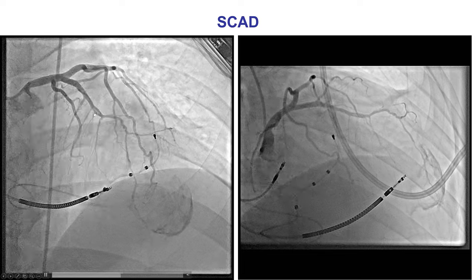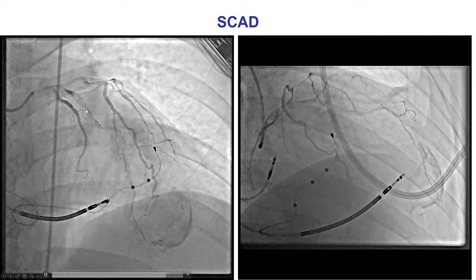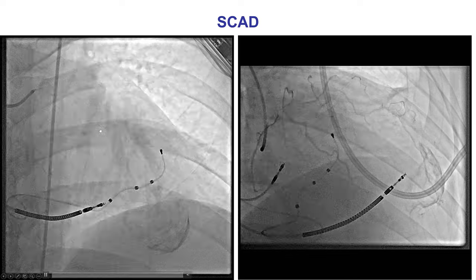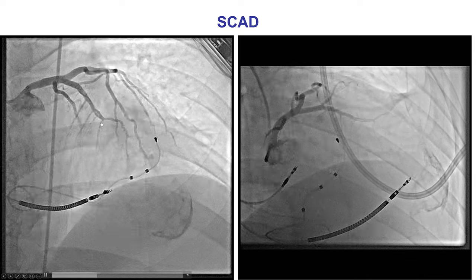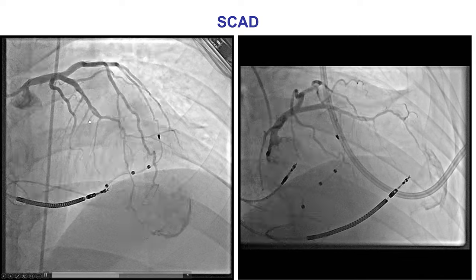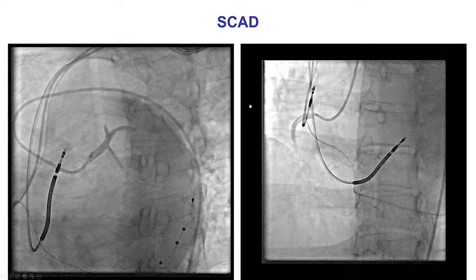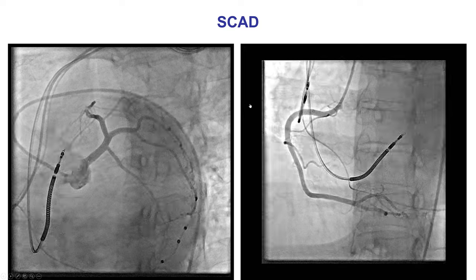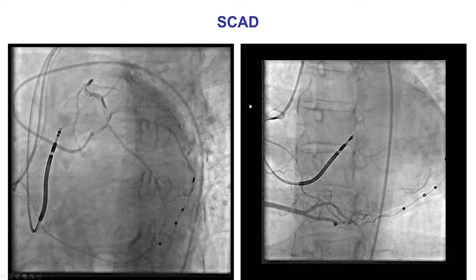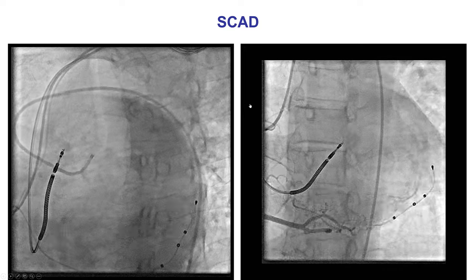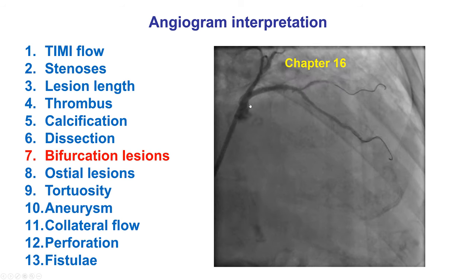Sometimes coronary dissection can be spontaneous. This is an example of spontaneous coronary artery dissection (SCAD), which usually occurs in women in the peripartum period, but can happen in other patients as well. SCAD can sometimes have multifocal involvement.